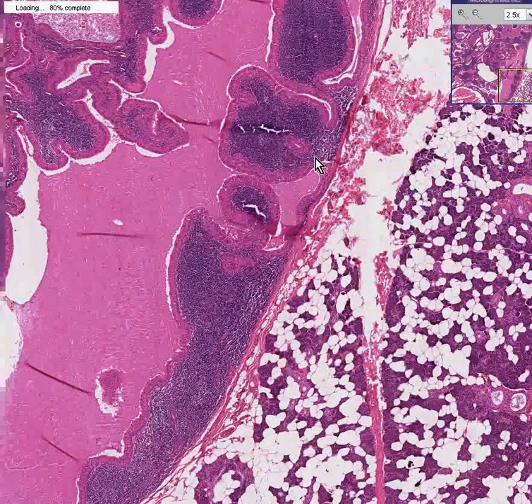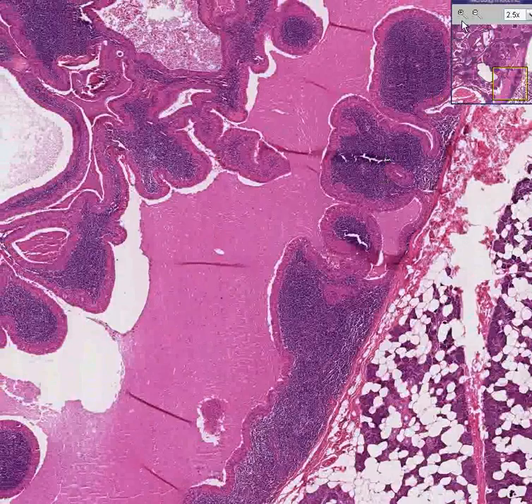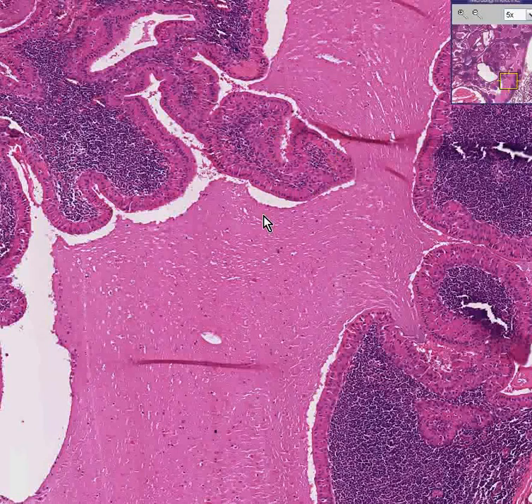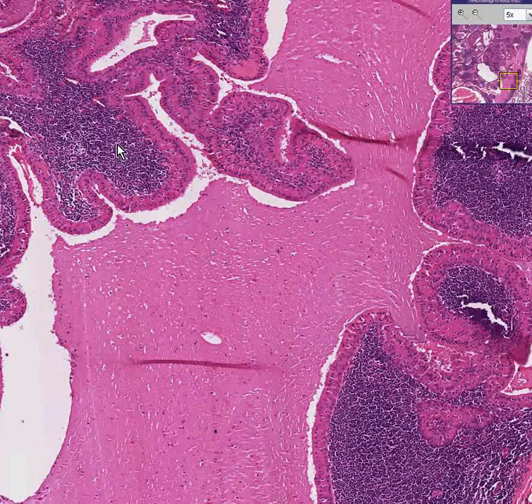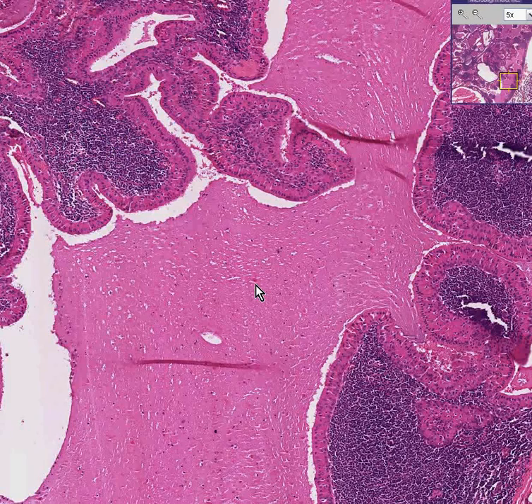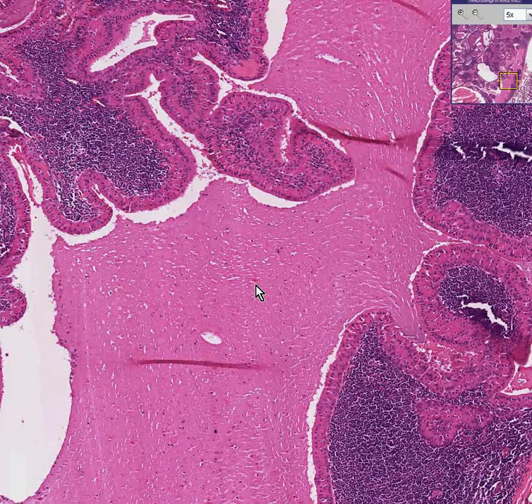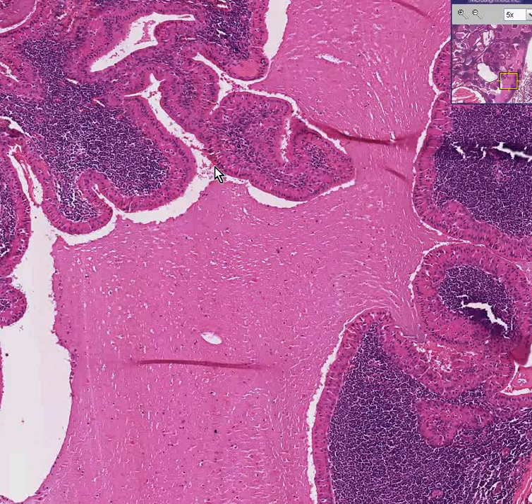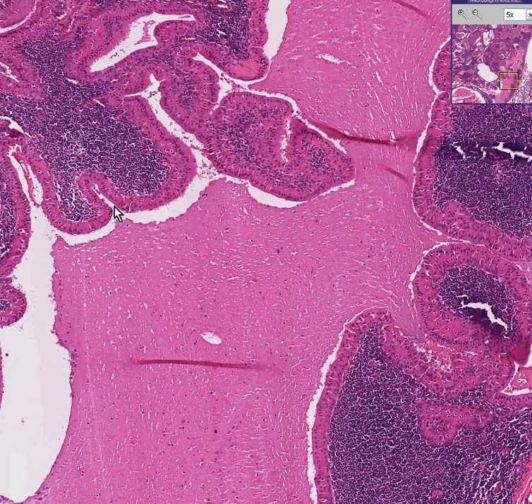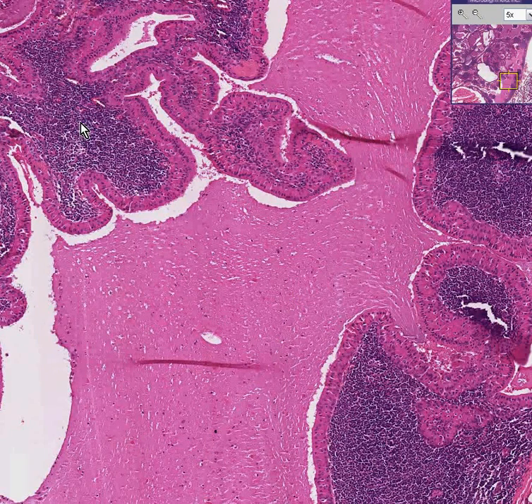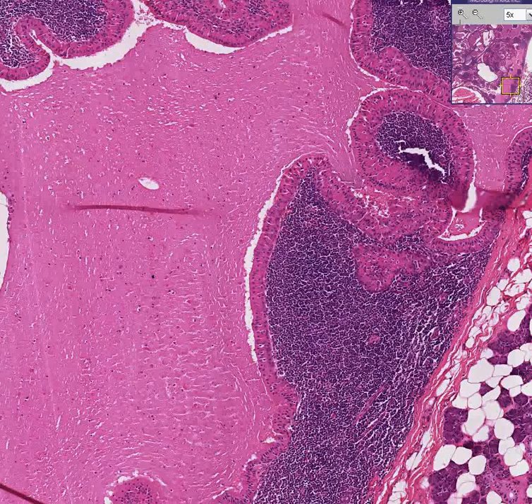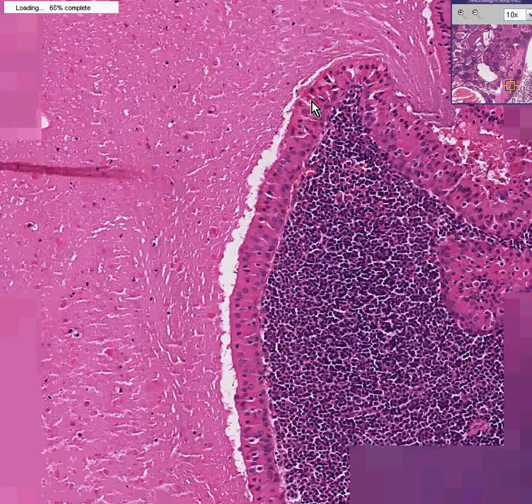This second most common type of tumor, however, grows in a papillary fashion. It has a lot of cysts in it and there are a lot of lymphocytes. So if you know how to put that together in Latin, you'd probably call it a papillary cyst adenoma lymphomatosum — papillary because these are all papillae, cysts because large portions of it are cystic, and lymphomatosum because there's a lot of lymphocytes in here. Remember, cyst adenoma because the cells and the glandular portion look and behave totally benign.